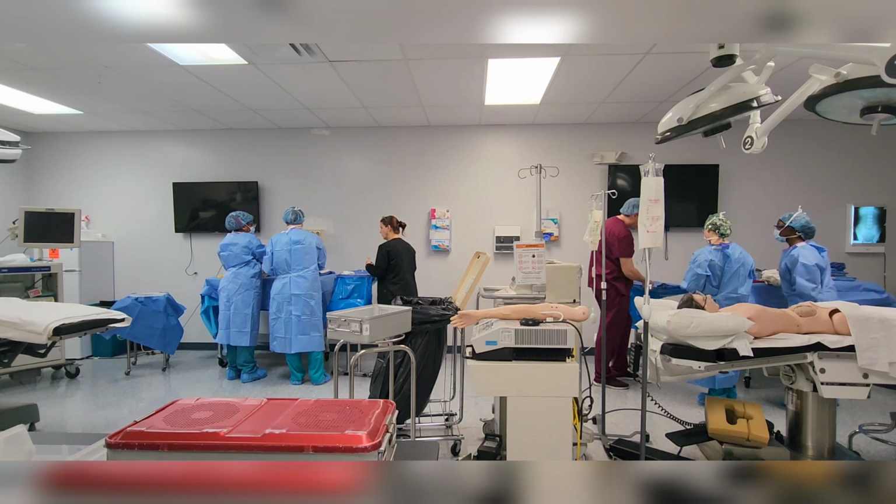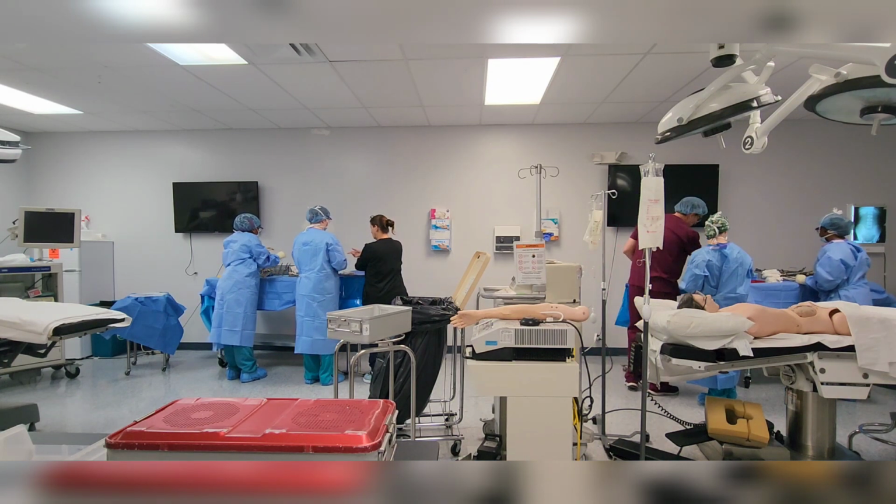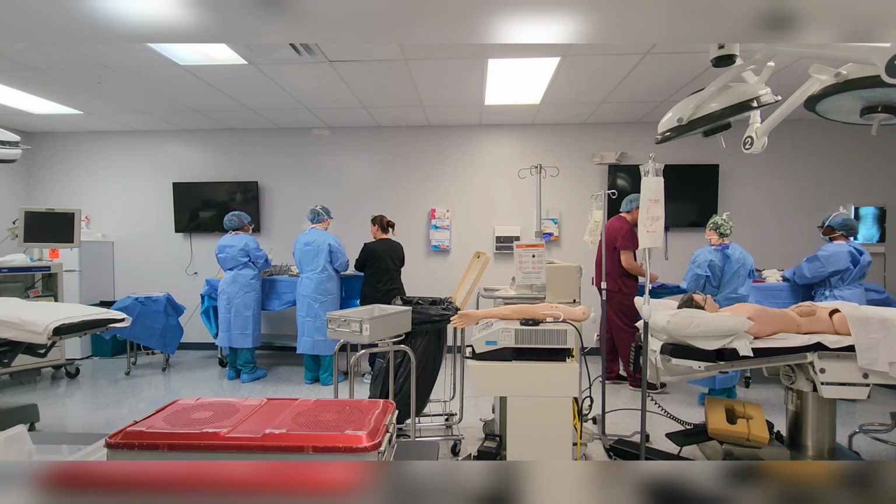So doctors, I don't even do it, but I also want you to label the skin marker. Take them and turn them around, so flip them the other way. Yep, because you'll start with the Kellys before you get it off.